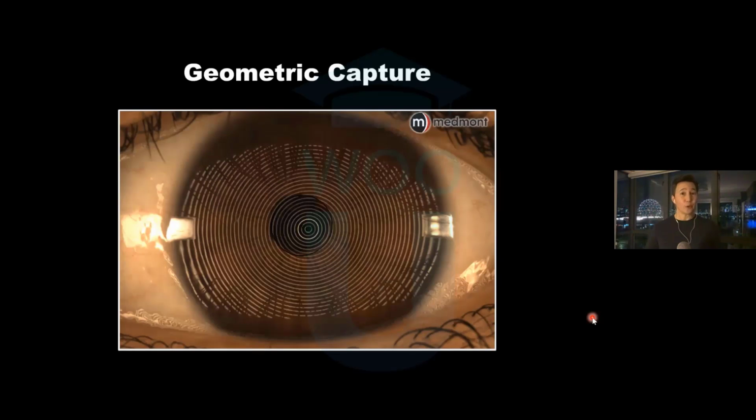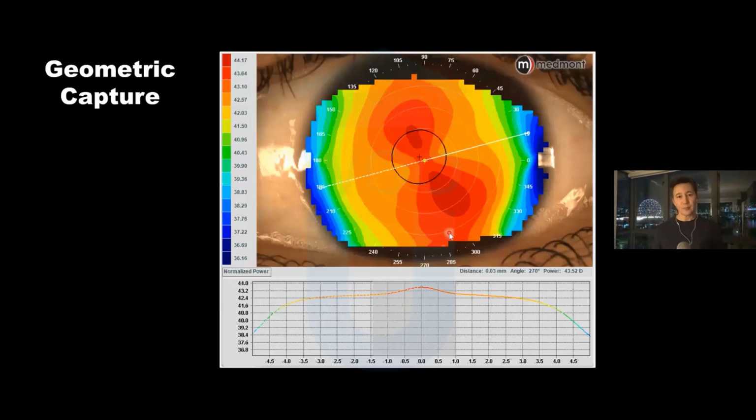And what we're looking for is when you look at the photokeratoscope image, you notice that the rings look like they're about equidistant from the border of the visible iris. So we have centered that placido photo. We've snapped our photo when the patient has the right fixation to get that perfectly centered topography. Then when you look at the colorized map, you can see how accurate this is likely to be in terms of capturing the cornea laterally.